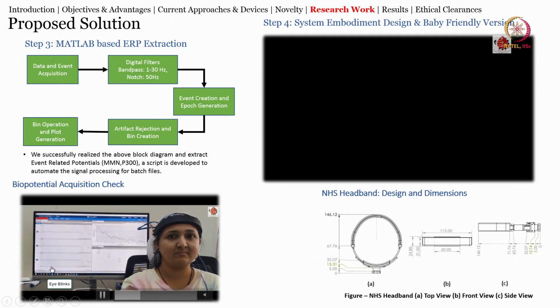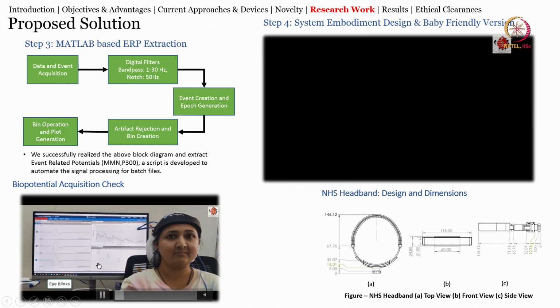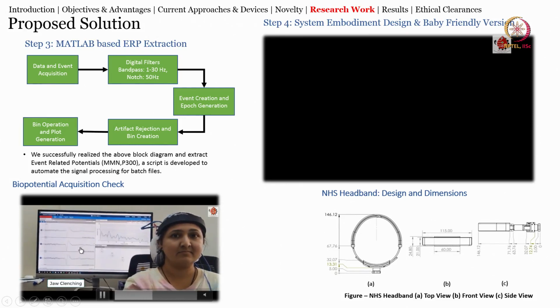Okay. So, what exactly do you see in this video? These are the waves that are coming off, right. Whenever she clenches, you see the signals are different. Whenever she is blinking, the signals would be different. I will just play it again. You see that whenever she is blinking, the signals are different. Now, whenever she is clenching, it will be different, you see.